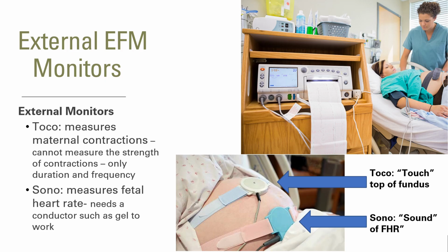So again, TOCO for touch, so that's for your fundus, the top of the fundus, and then sono for the sound of the baby's heart rate. That will usually be at the bottom.